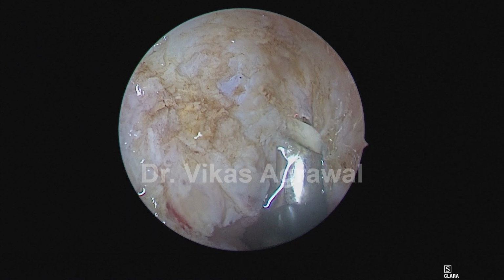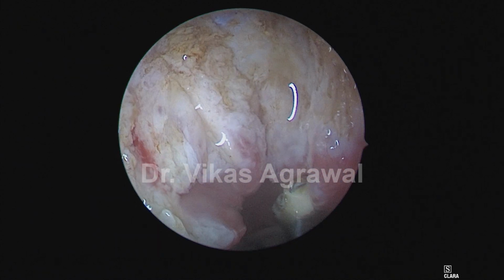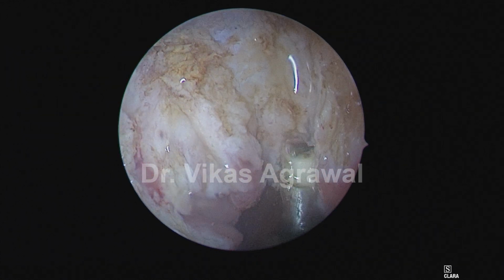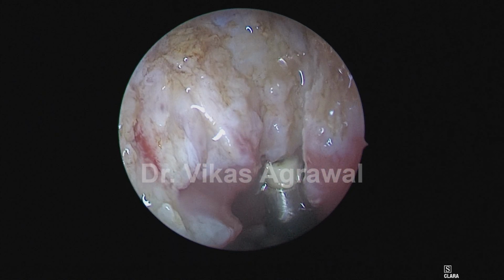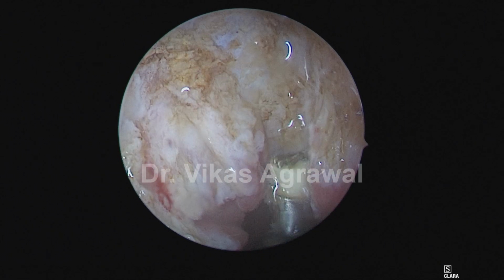It's the area behind the torus. That's the inferior boundary where we are actually working now. Inferior boundary is the Passavant's ridge.